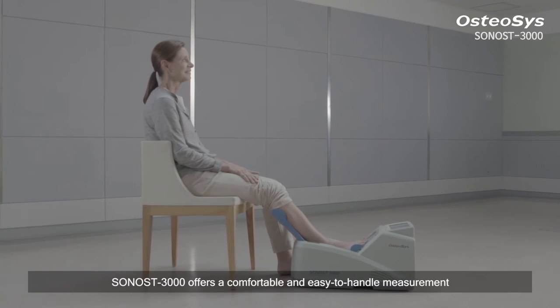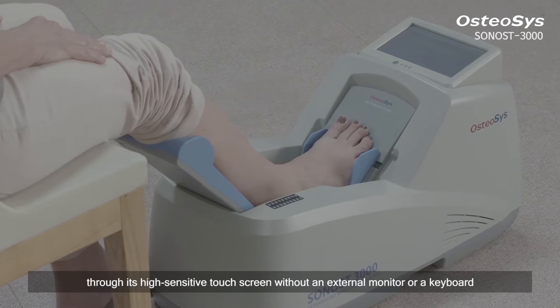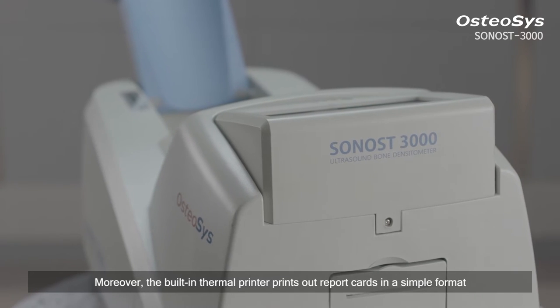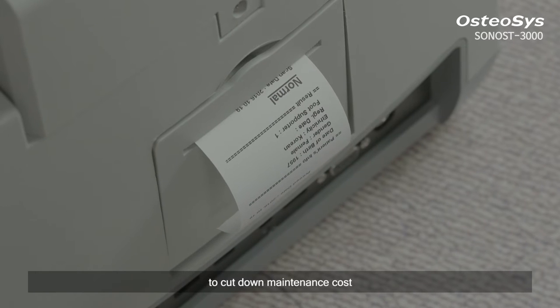SONOST-3000 offers a comfortable and easy to handle measurement through its high-sensitive touchscreen without an external monitor or keyboard. Moreover, the built-in thermal printer prints out report cards in a simple format to cut down maintenance cost.